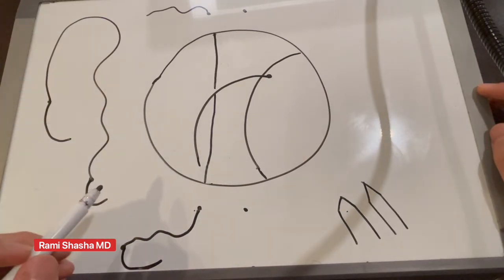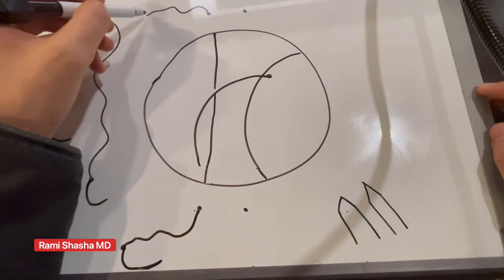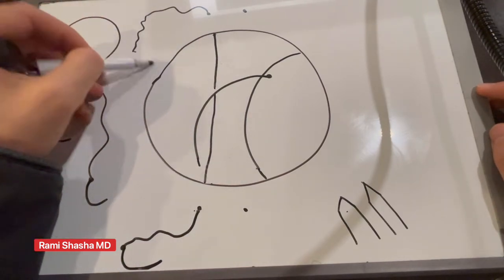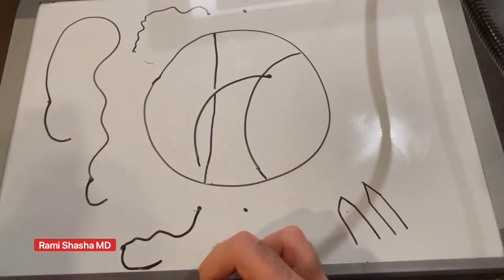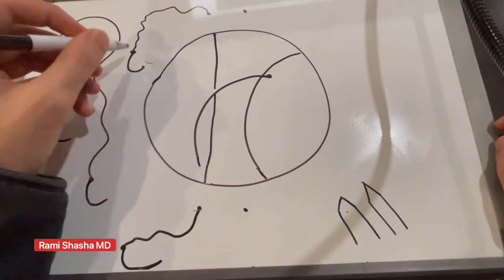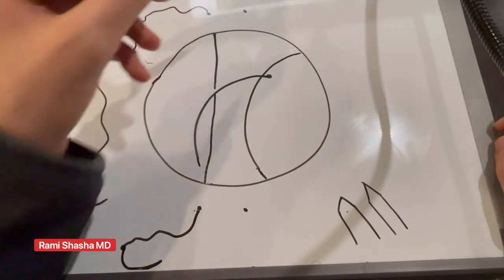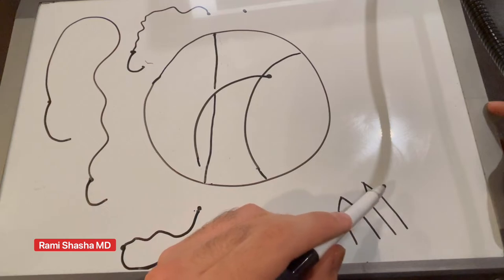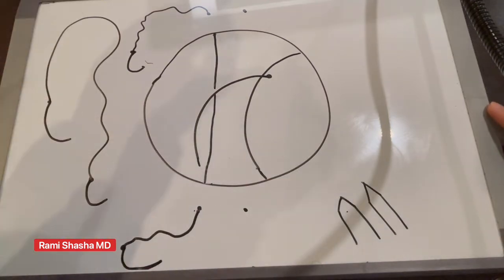You're going to repeat the same thing. Remember this is a double arm so we're going to now grab the other needle because it's double armed. We're going to pass it through here and then feed the needle into another 27 gauge hypodermic needle.